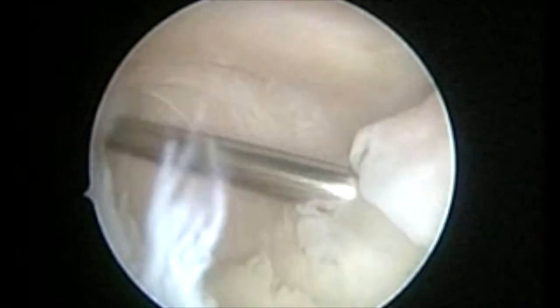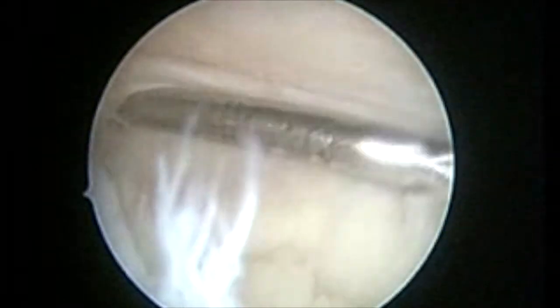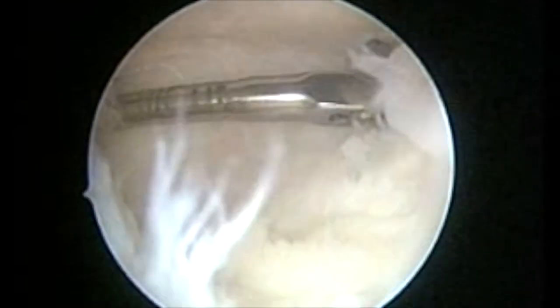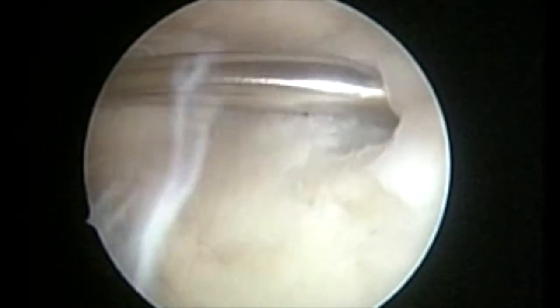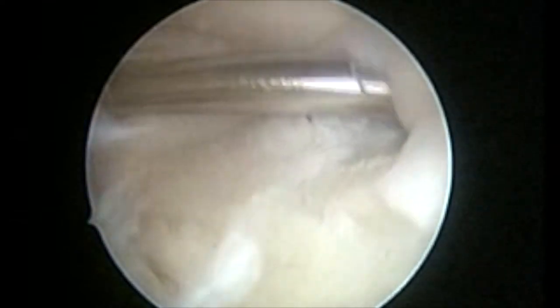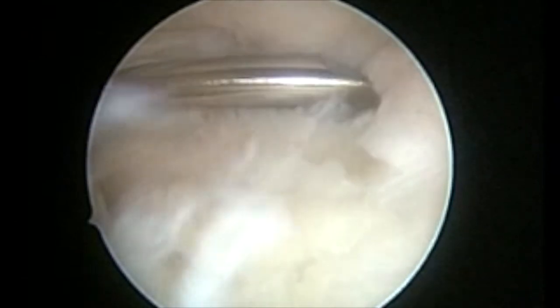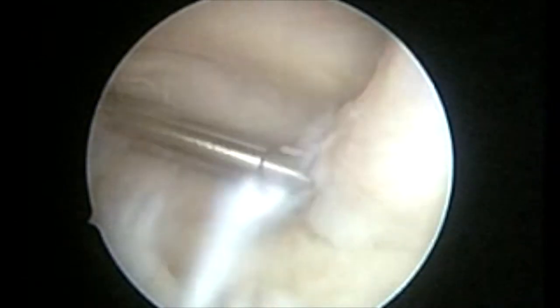A basket punch and a motorized shaver can be used alternately to enlarge the opening. It is very important to mention that while using the motorized shaver in the posterior compartment, the suction should be very low. Otherwise, you can damage the neurovascular structures in the posterior compartment.